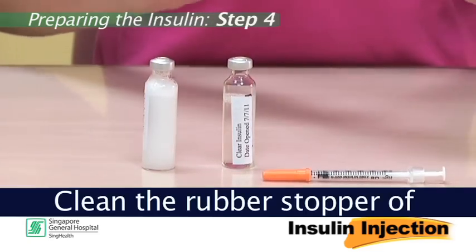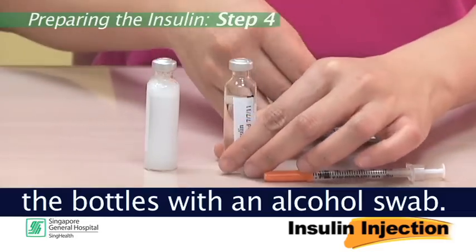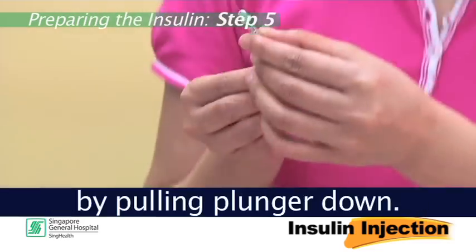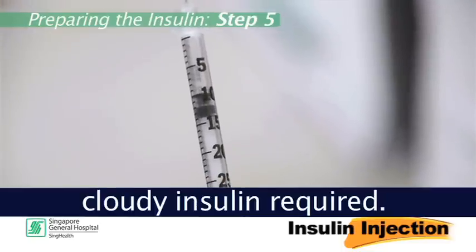Step 4: Clean the rubber stopper of the bottles with an alcohol swab. Step 5: Next, draw air into the syringe by pulling the plunger down. The amount of air should be equal to the dosage of the cloudy insulin required.